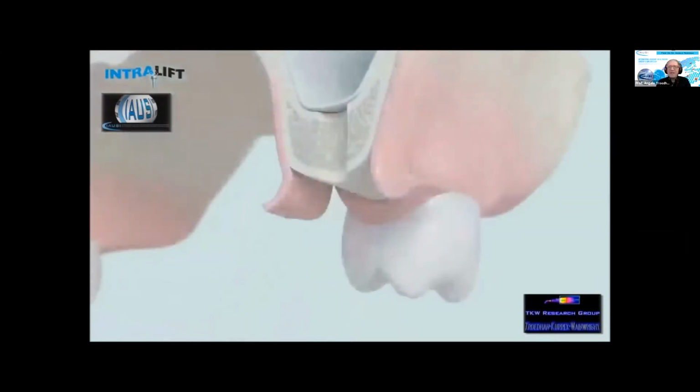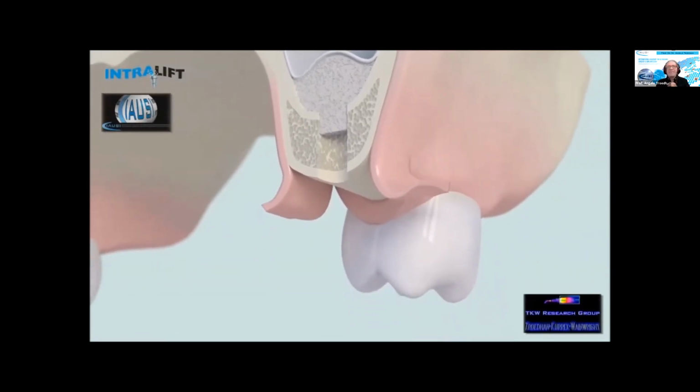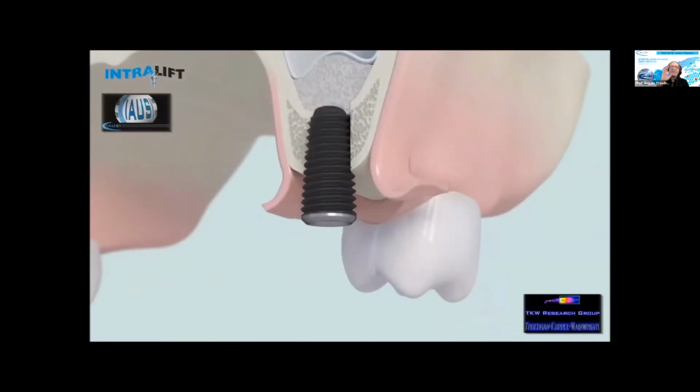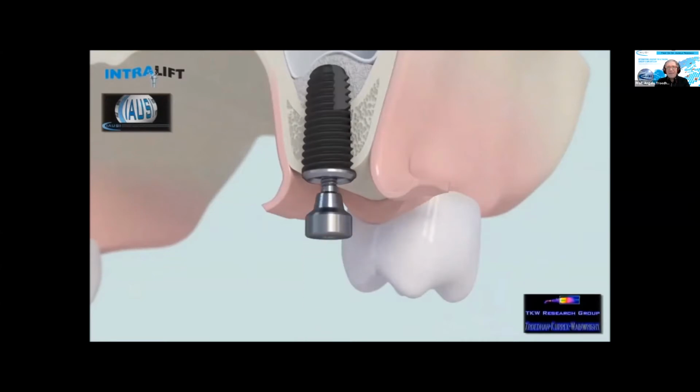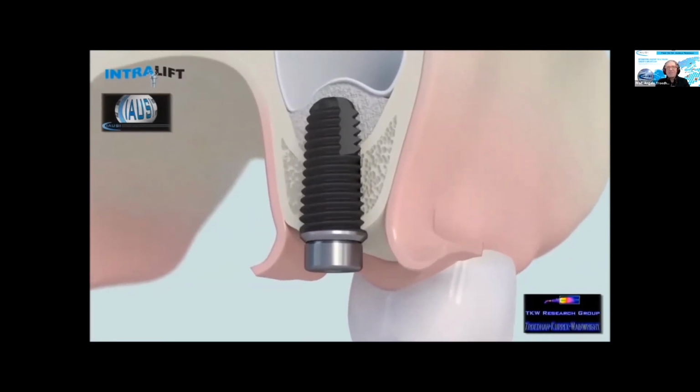For this, there is another tip that we place here to widen the approach, the transcrestal approach, to 2.8 millimeters. And then I admit this takes the longest time because it's just a very, very small transcrestal approach, 2.8 millimeters. It takes some time until you can fill the subantral scaffold.